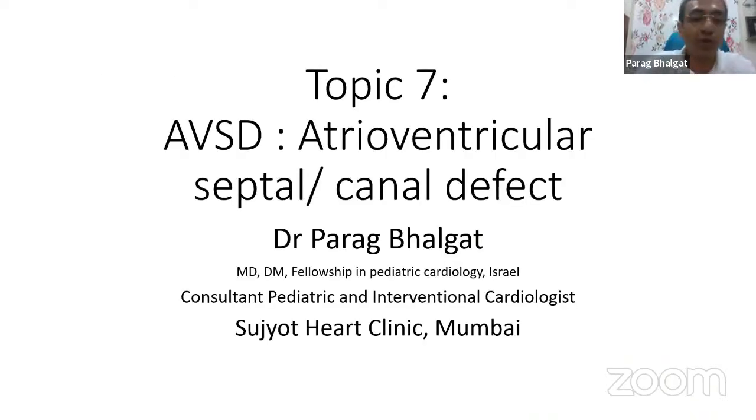Now coming to an important topic of atrioventricular septal defect. This is a big spectrum and it is associated with many varieties of cardiac anomalies. So I'm going to go in detail and I'll try to cover multiple things in this. Hope you will understand the spectrum and get acquainted with this.